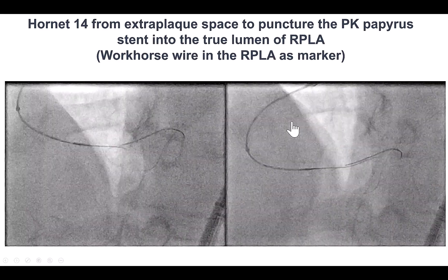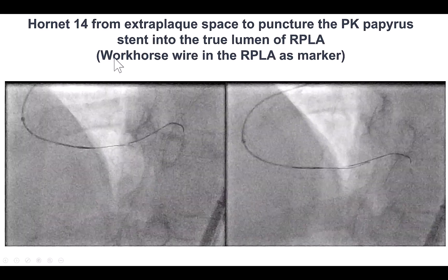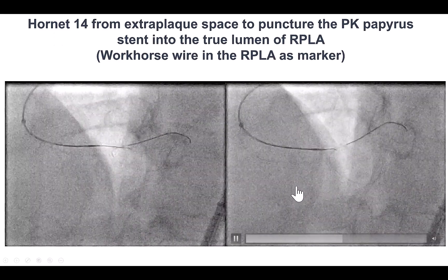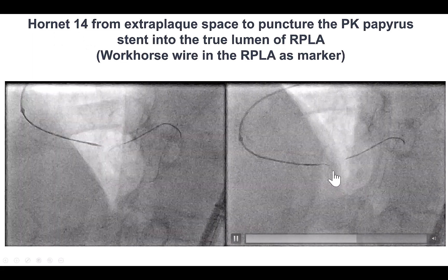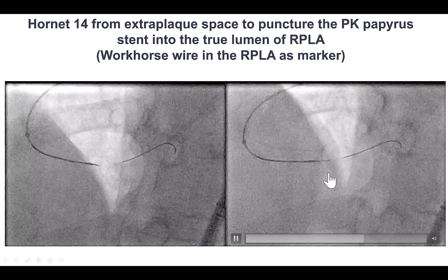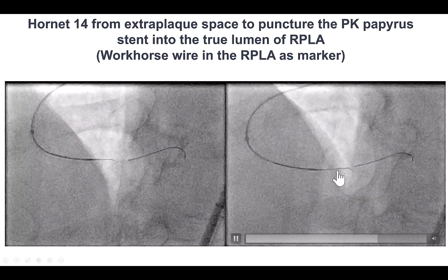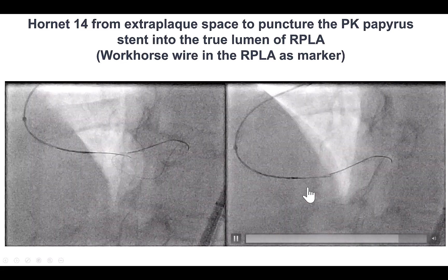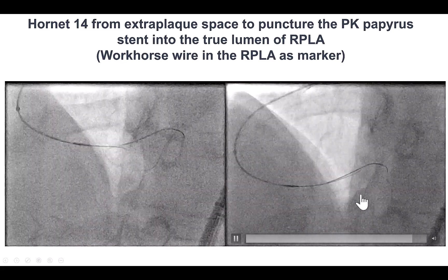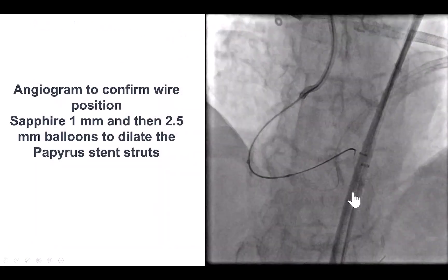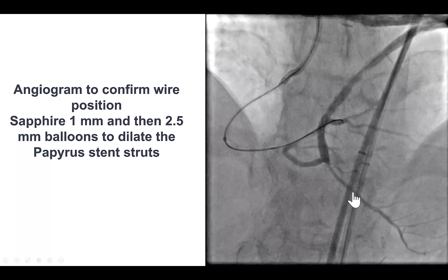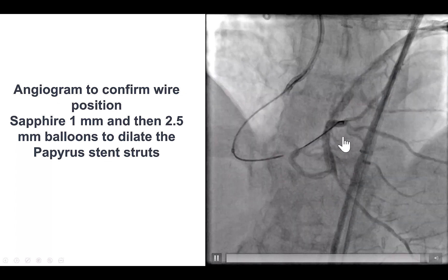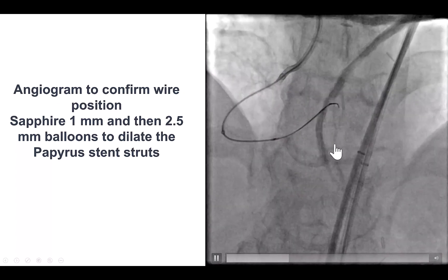We advanced the microcatheter and then used a Hornet 14 guide wire, using the antegrade wire as the target. By doing that, we were able to puncture through the papyrus and advance the Hornet along the right posterolateral. Injection from the saphenous vein graft confirmed that we were inside the distal true lumen.